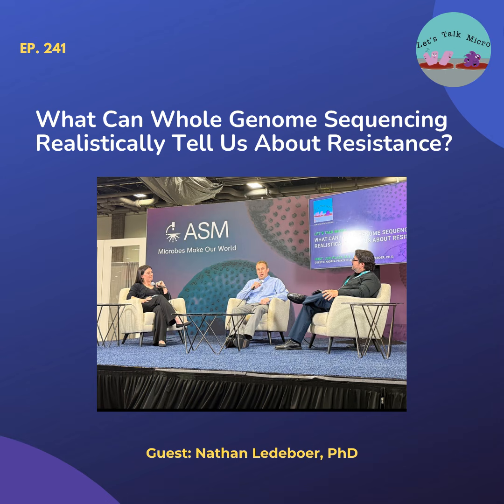But I think as we start to really get into AST testing, when we're not just identifying an organism, but we're identifying individual point mutations, I think there we're really going to need advanced tools to be able to help us identify those, and then using data that exists from phenotypic AST help us to correlate that. So I think being comfortable with bioinformatics, being comfortable with some of the tools that are available, and then being comfortable with the data is going to be critical.